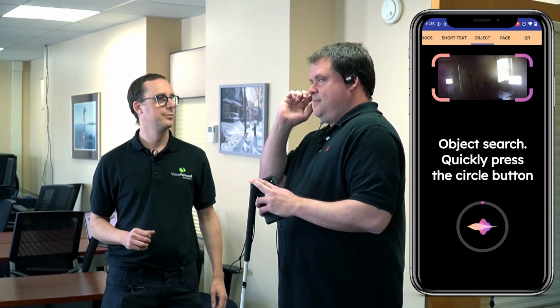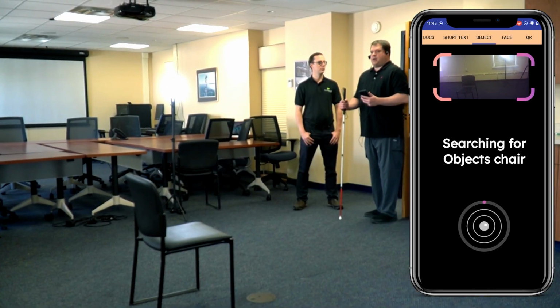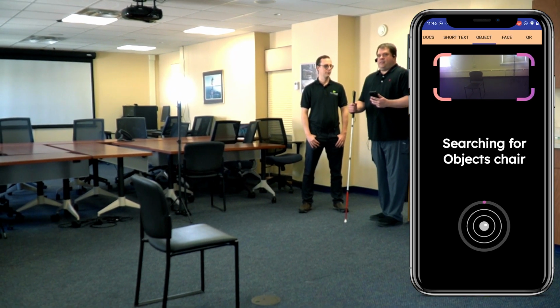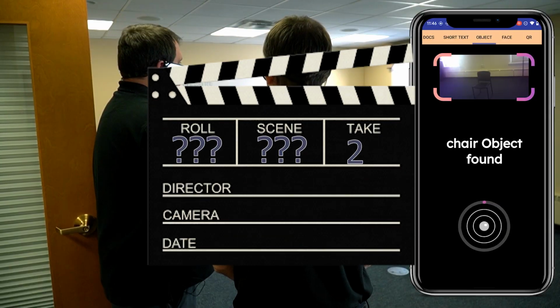Perfect. Object search. There we go. Quickly press the circle button to search for another object. Looking for chair. All right, so it defaults to chair. So now I'm going to just slowly scan the room. If I hear a beep, then I know I've found a chair. Scrolling. All right, Luke, I just made 2 passes and it did not work.